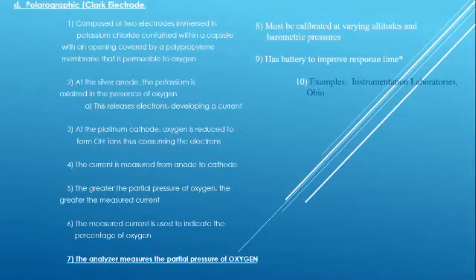Now, this one has a silver anode. So at the silver anode, the potassium is oxidized in the presence of oxygen. This releases electrons, developing a current. At the platinum cathode, oxygen is reduced to form OH ions, thus consuming those electrons. The current is measured from anode to cathode. So we've got silver and platinum on this one, okay? The greater the partial pressure of the oxygen, the greater the measured current. And the measured current is used to indicate the percentage of oxygen.